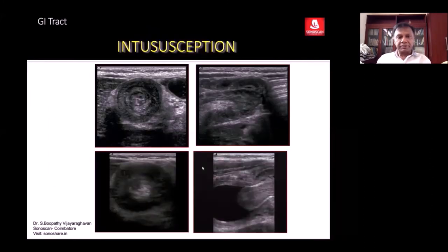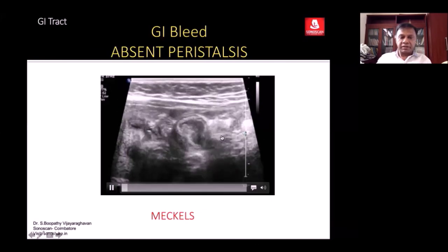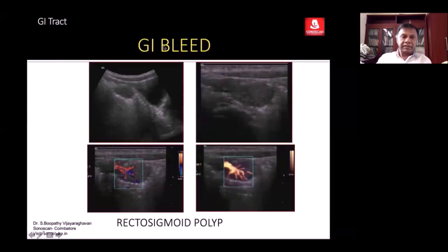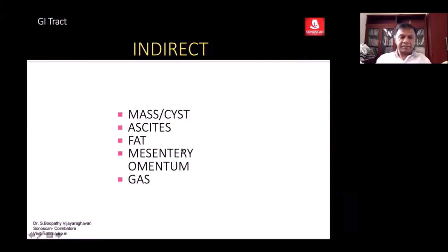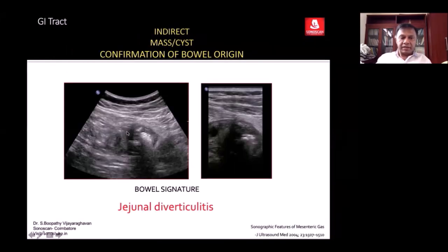Intussusception — typically referred because of clinical presentation with diarrhea and pain abdomen — shows absent peristalsis as the clue, while the rest of the bowel loops are normal. With this clinical history you suspect a polyp and use high frequency — you see the polyp outlined by gas. Mesenteric abnormalities are discussed in a separate lecture. A jejunal loop adjacent to a cyst showing the bowel signature in the wall of the cyst, along with a tubular lesion adjacent to the jejunum with thick walls and gas.